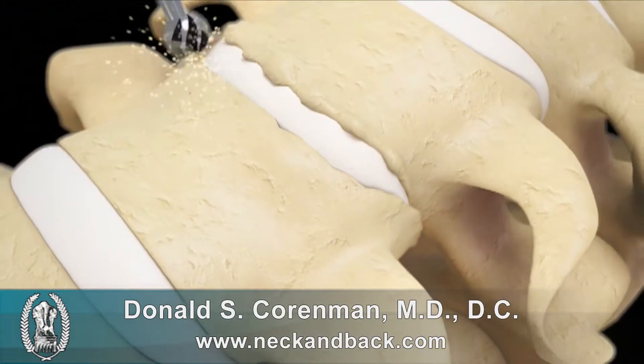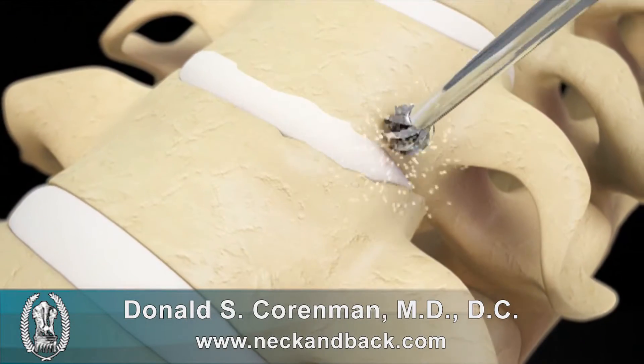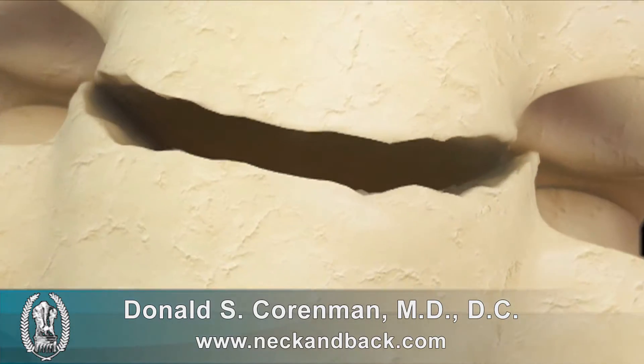You first start at the level of the bad disc where you remove the anterior bone spurs. Then you remove the disc.